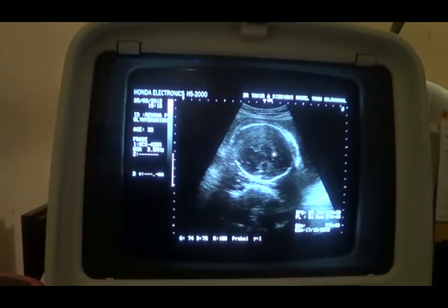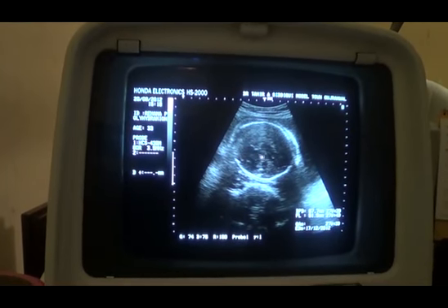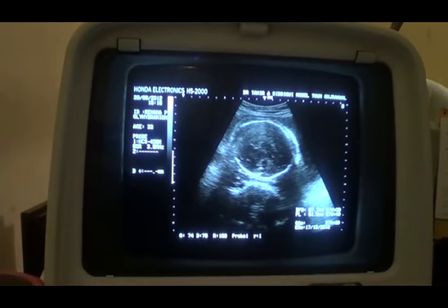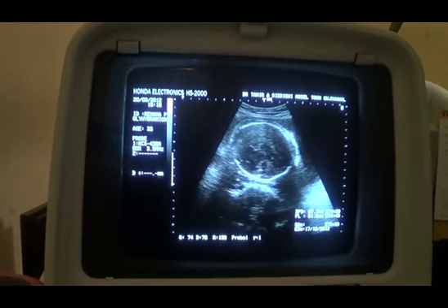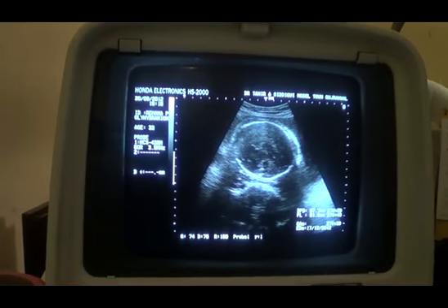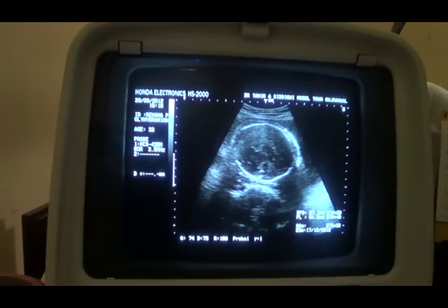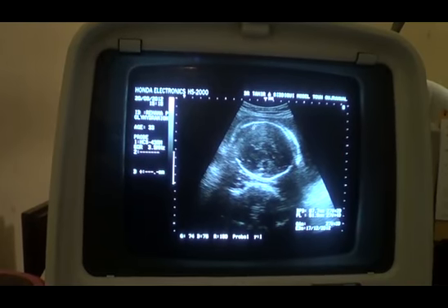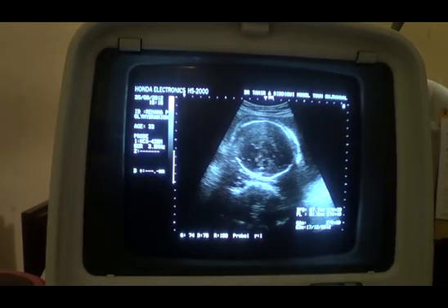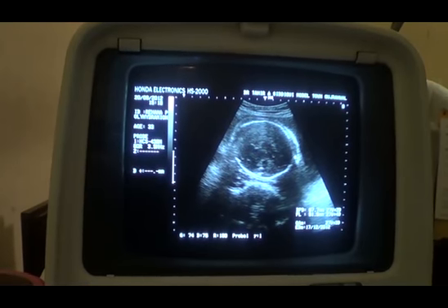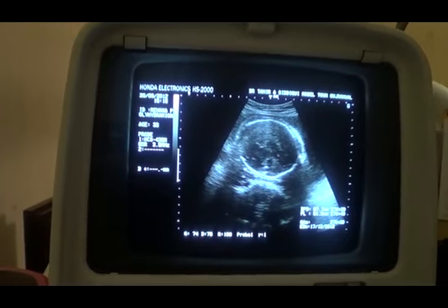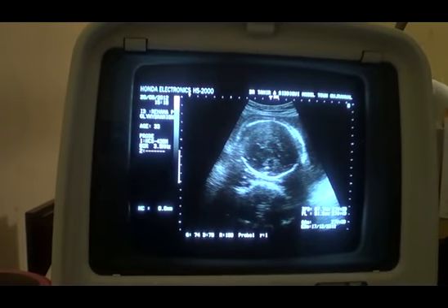This is the CSP, these are the thalami, this is the falx cerebri, and this is the interhemispheric fissure. The internal anatomy is fine — absolutely normal — and no dilation of the ventricles is seen.